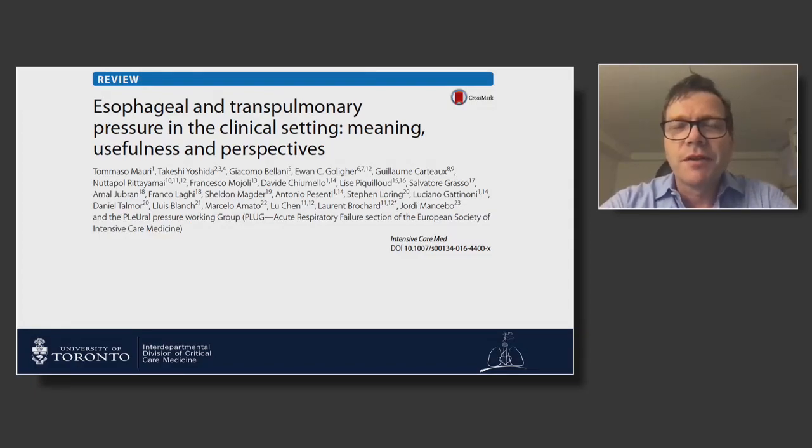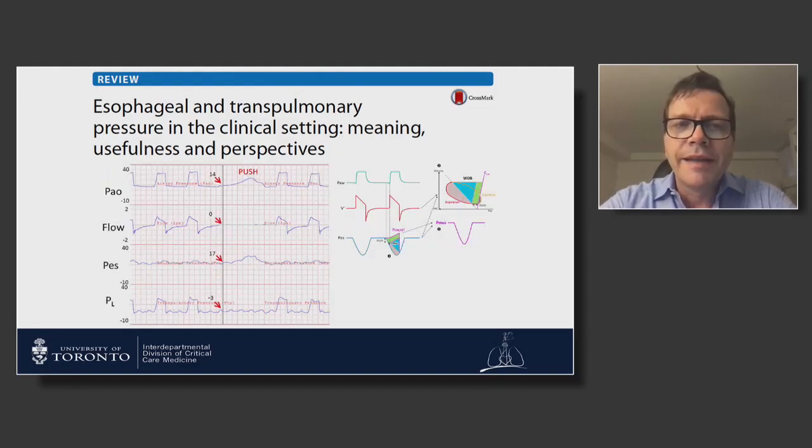So how to measure effort? A few words about that. I don't expect you to start measuring pleural pressure if this is your first time interacting with a ventilator, but just so you know, the reference standard for effort would be an esophageal balloon. Next slide. And that allows you to measure pressure time product and know exactly what the patient is doing and when. Perhaps more useful for this talk, though, is that there are several ways that we can measure and estimate effort relatively easily and non-invasively. Next slide.